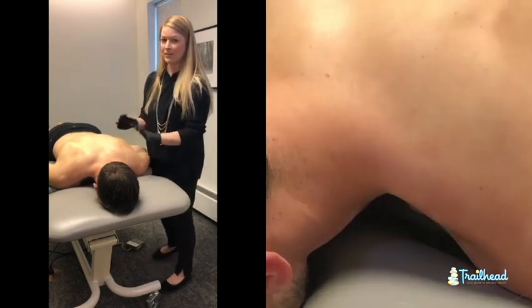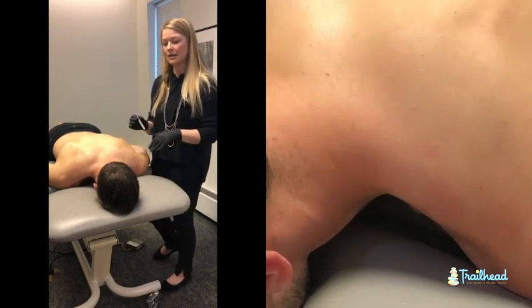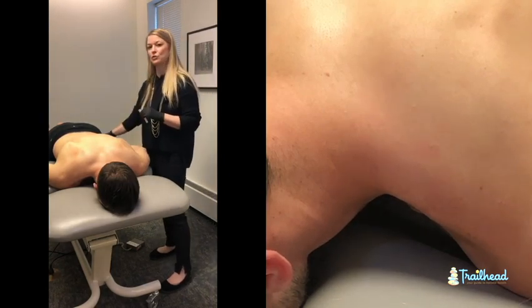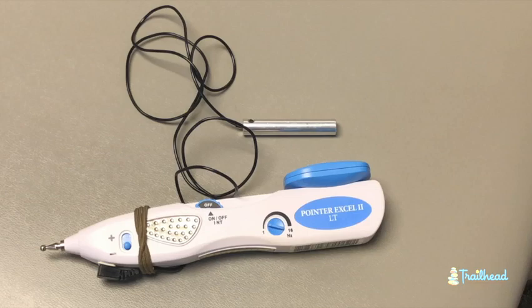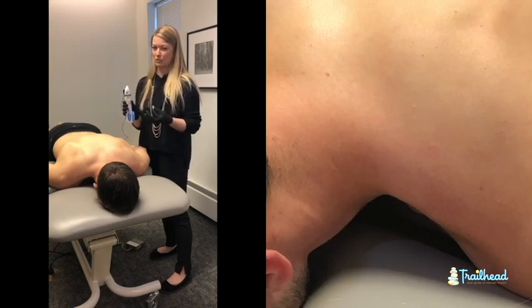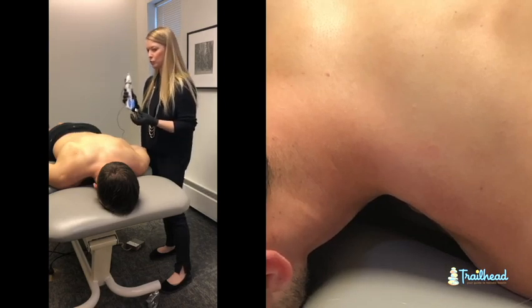So without further ado, we have Mike prepped, we have cleaned his skin, we have our needle ready to go. We also have Mike holding on to the end of our stim unit. We are going to use some TENS stim as an addition to our treatment today so you can see what his muscles are doing and also to make sure Mike doesn't walk away quite so sore. We will turn that on in a second.